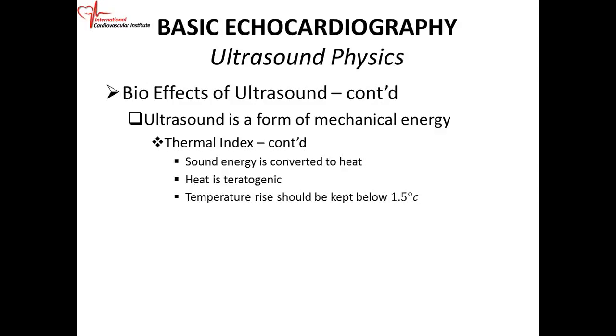And temperature rise should be kept below 1.5 degrees Celsius when you're doing fetal work. Does it matter how long? Right, it's a time thing. If you're doing fetal work and you spend an hour, you increase the chance of heat production and mechanical injury. And if you use Doppler as opposed to 2D, then you increase the chance of heat production and mechanical injury even more.